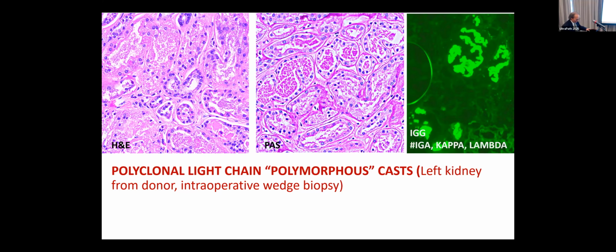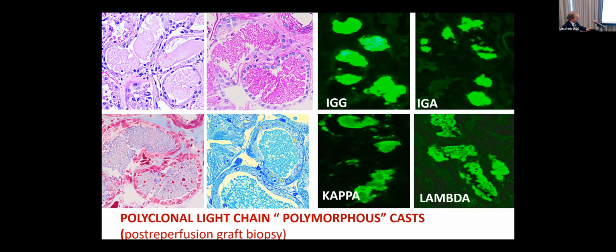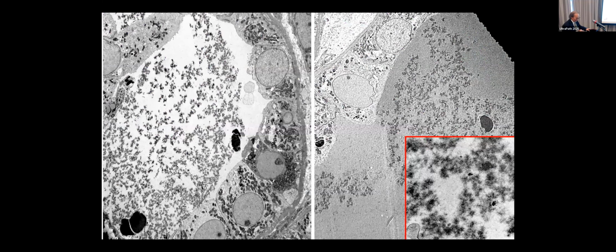So this case is quite similar to the previous one. So we go ahead and do electron microscopy on both of them, and that's what we see. We see material like this here. It has, again, this structure here, distal tubule, and there is a very dense granulated material. And this was the time I guess Dr. Herrera would tell you, okay, that is the light chain molecule, but it's polyclonal.